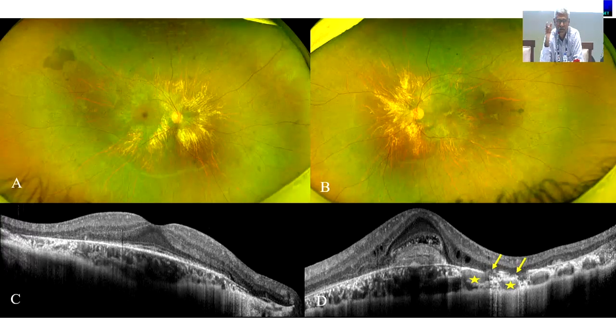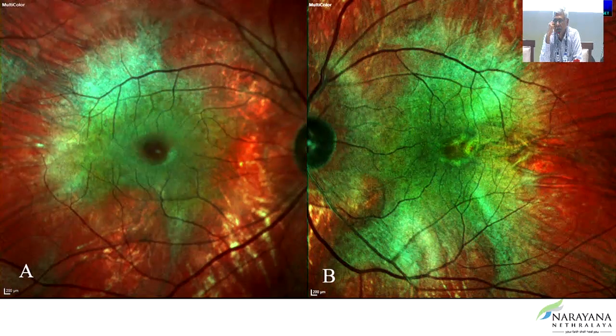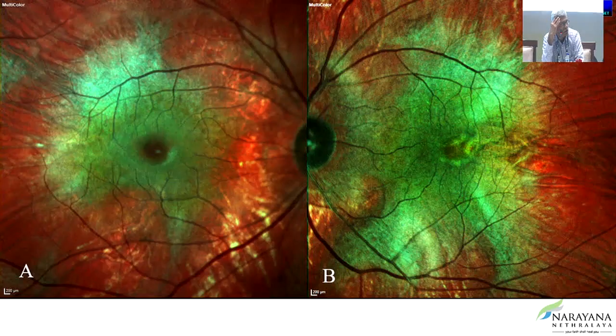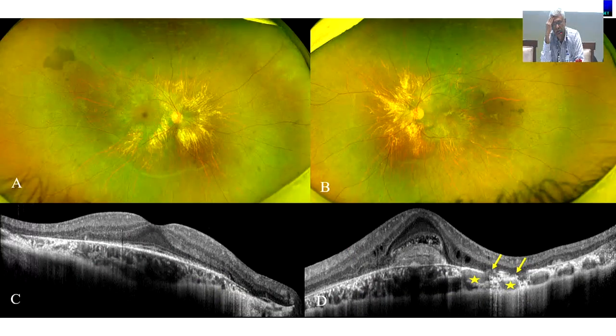But she's a myope, is it? What is the refractive condition? I'm not very sure actually. I haven't put in the refraction. I don't think he's a myope. But on what basis did we make a diagnosis of choroideremia? Because of the fundus picture itself. This is not classic choroideremia appearance because more of nasal changes are there and then patches are there. But of course, I don't know how choroideremia appears in a teenager. Yes, that's also there. But this didn't fit anything else. In fact, we've asked for genetic testing also in this particular patient.